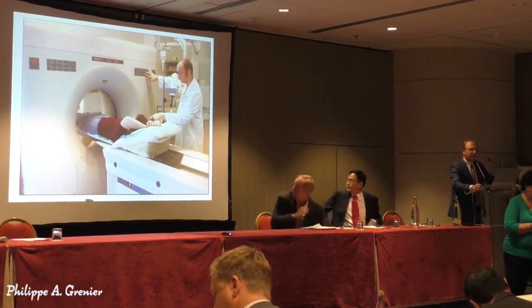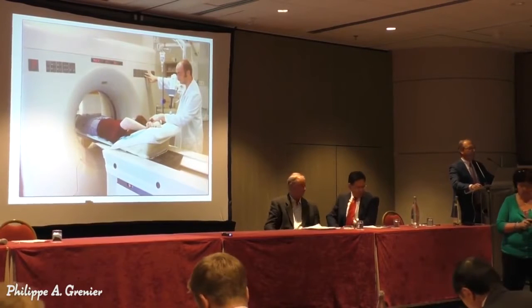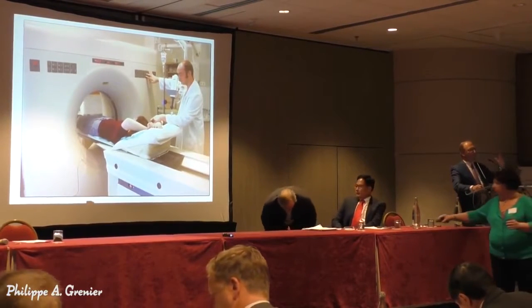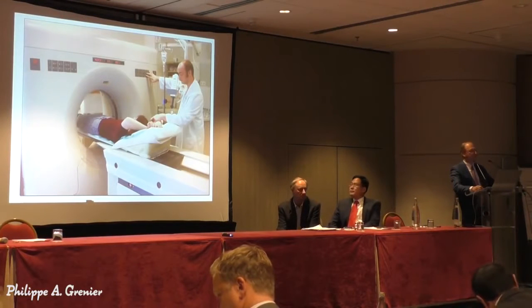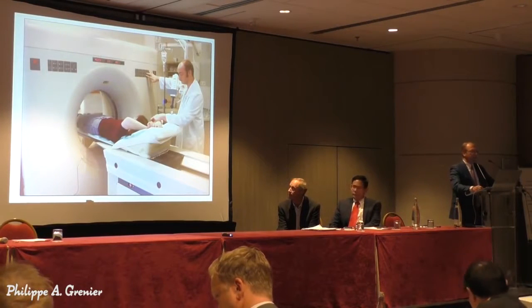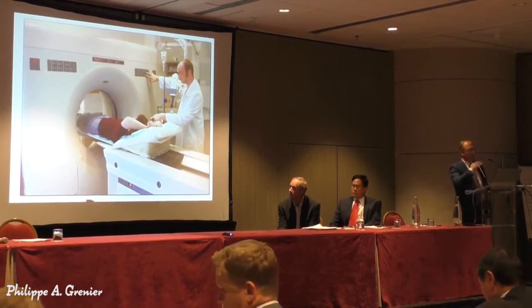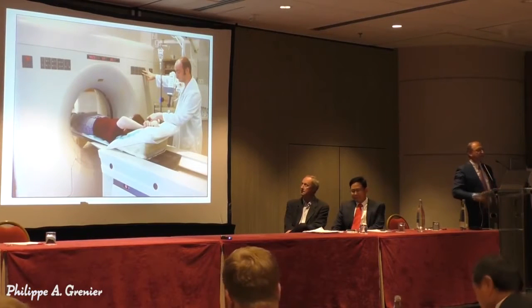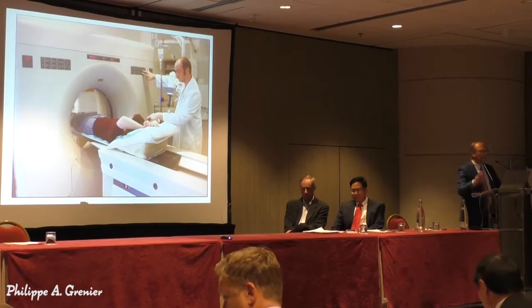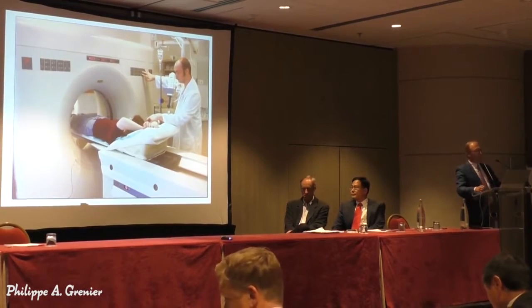For thoracoabdominal lesions in these patients, the primary imaging modality is computed tomography. The new CT scanners permit us to evaluate the entire chest, abdomen, and pelvis in a single 20-second breath hold. So the patient is put in a supine position.